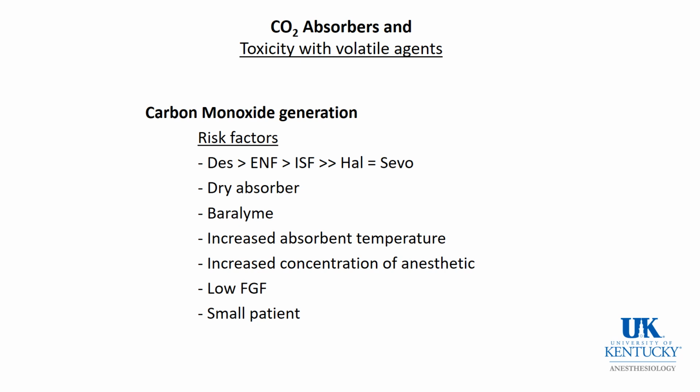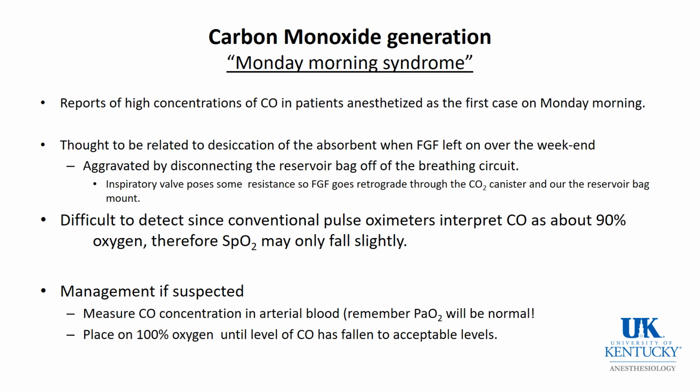It was worse with baralyme, but it's also a problem with soda lime. The real problem is if the absorbent gets dry. For this reason, a phenomenon called the Monday morning syndrome was reported.